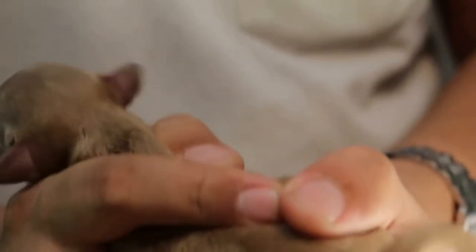So this is what I'm going to demonstrate now. The assistant holds the puppy for the procedure.